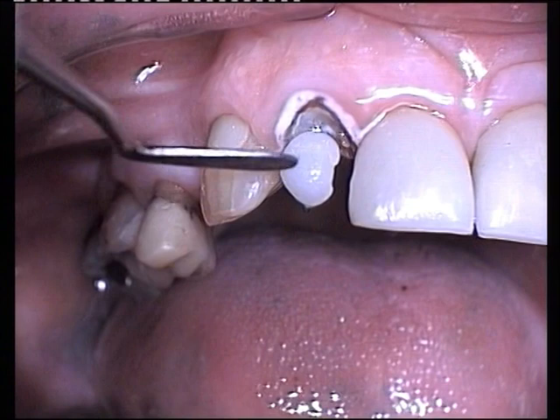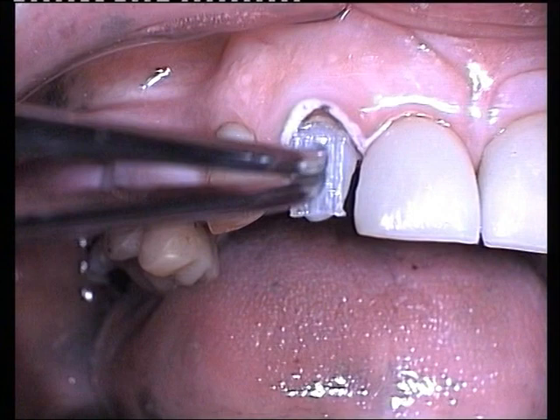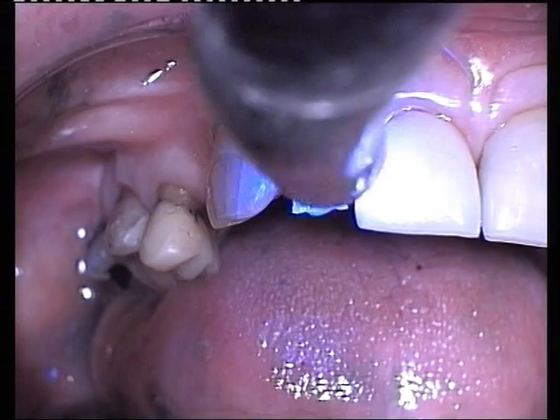A fibre-reinforced composite resin is placed over the post and a pre-cut resin-impregnated ribbon fibre tape is puddled into the surface. The resin and fibre are spot-cured for 10 seconds.